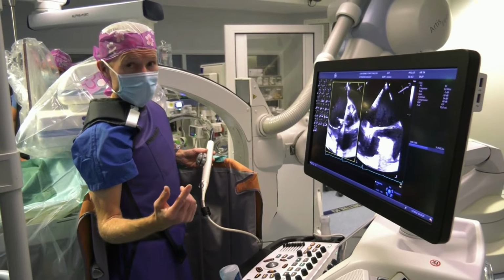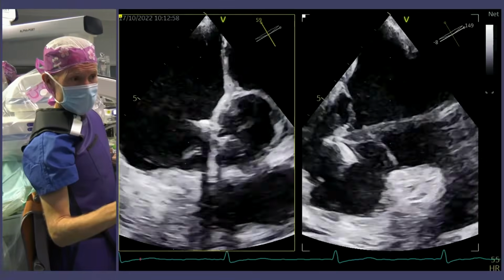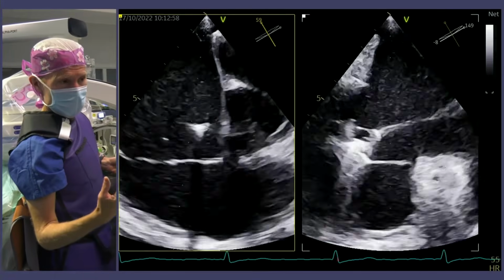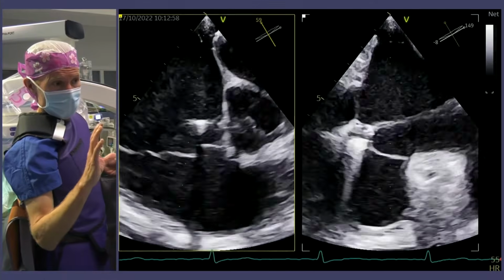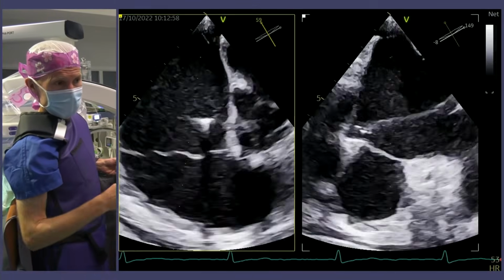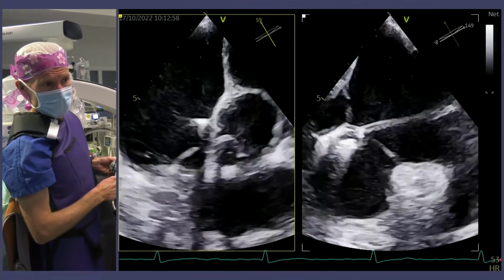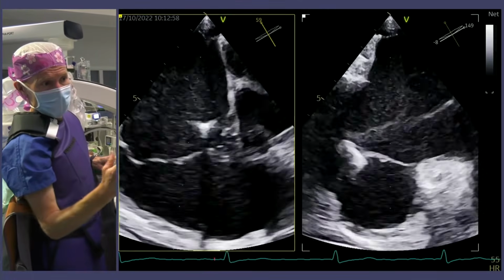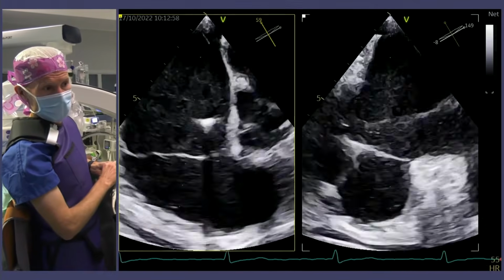We were still not very happy with the orientation of the guiding catheter, so we still try to optimize the way we put the clip in front of the leaflets. And you see that now we have quite a correct way to grasp both the septal and the anterior leaflet.